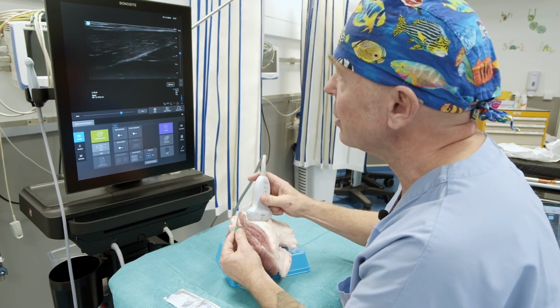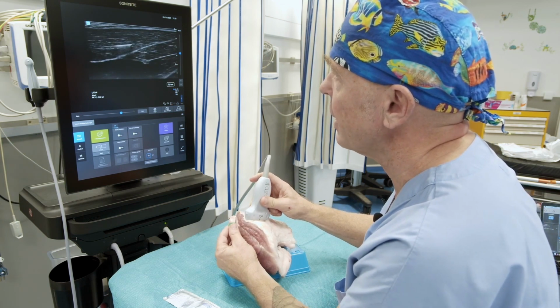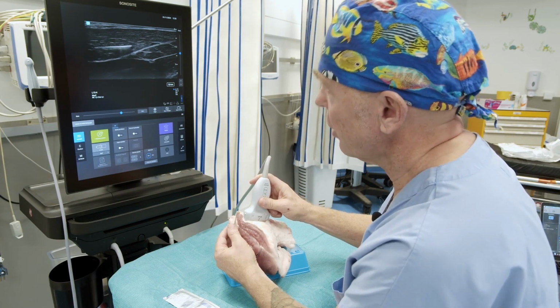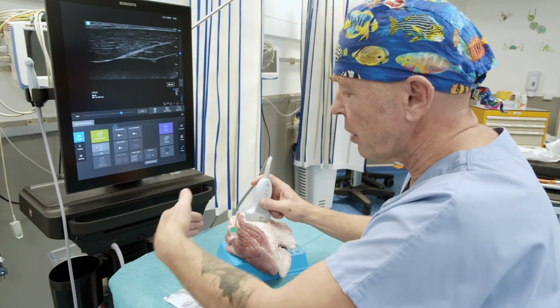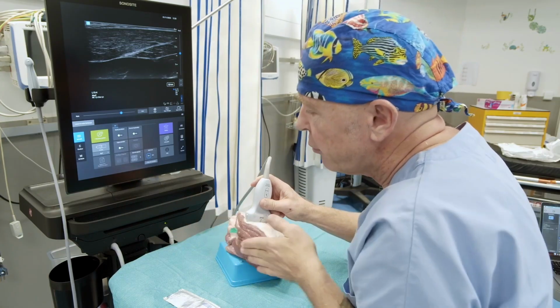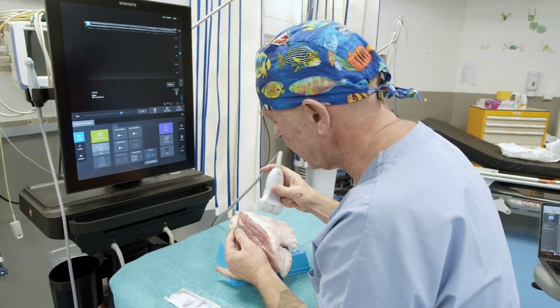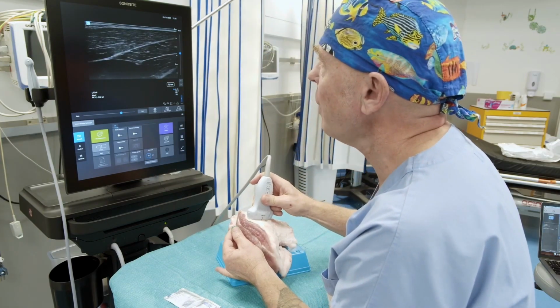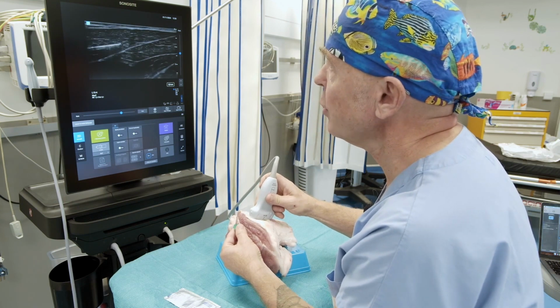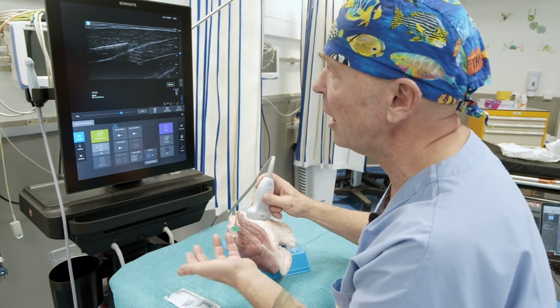Then you perform a small sweeping motion in this manner, and suddenly you observe your needle reappear. It may not be perfectly parallel, but you see the most crucial aspect is, you notice I had turned slightly and I realigned myself properly in the axis, somewhat like when performing a vascular puncture. You really need to see where the needle is going and then position your probe to retrieve it. So the exercise is very simple. You carefully watch the direction of the needle and make a slight tilting motion like this, and you retrieve your image. Relax. You capture the image, relax, and capture the image again. This is really something that will be useful to you, and you need to learn to master it.